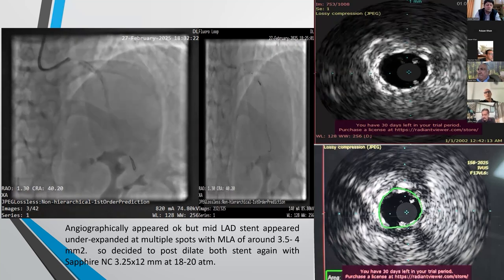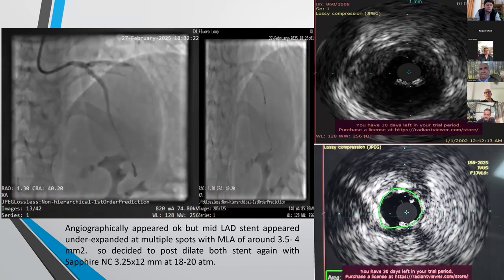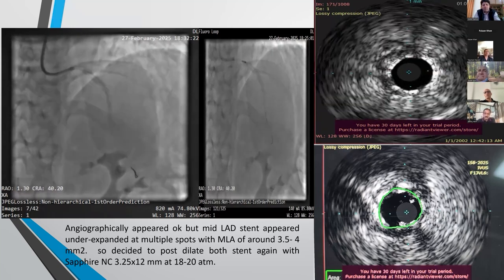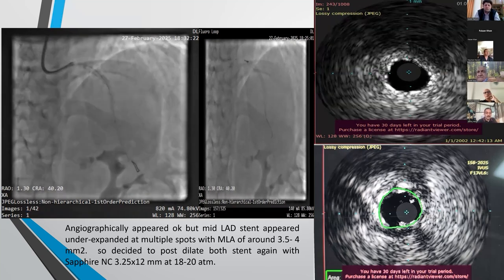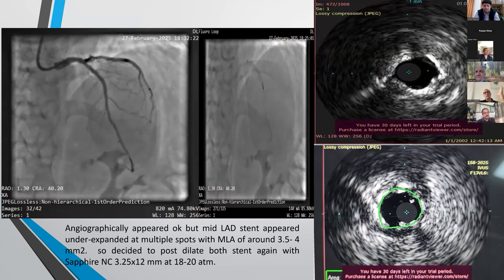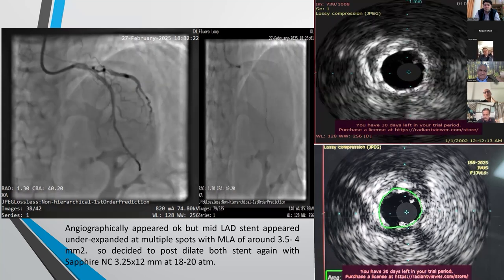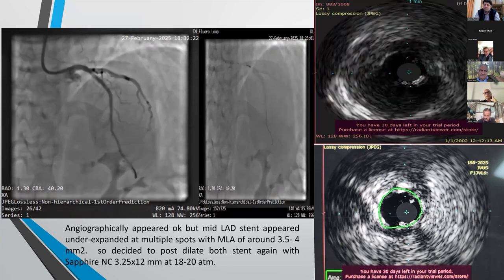Larger centers may have very standardized blood screening practices, but a lot of community centers and small centers don't, and they use kits which don't have the same accuracy in screening for Hep C and HIV. At least in certain parts of Sindh, we have seen outbreaks of disease. So that makes me a little nervous. I'm comfortable reusing FFR because it doesn't have a lumen, it's just a wire. I'd be a little hesitant to reuse IVUS. But the cost issue is real, and it's a major challenge.